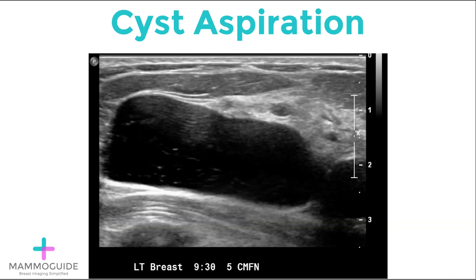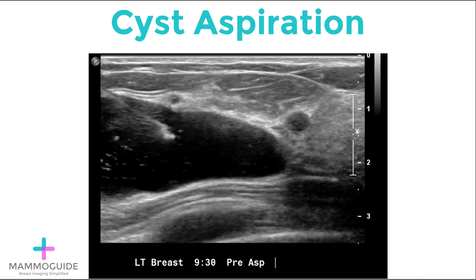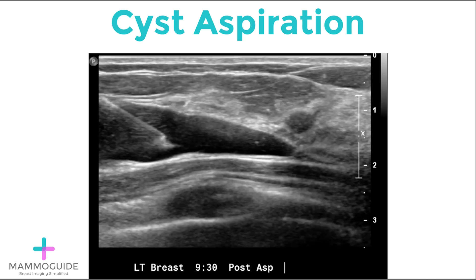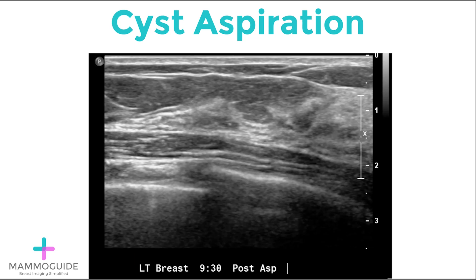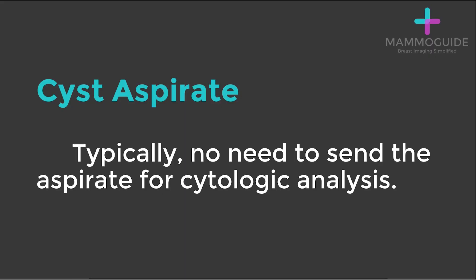First, find the cyst using the ultrasound probe. Clean the overlying skin with an alcohol swab. Next, using the needle, gain access into the cyst. Have your assistant pull back on the syringe, aspirating the fluid. Aspirate until resolution. Take a post-aspiration image to document what you've done. Usually there's no need to send the aspirate for cytologic analysis, as you are performing the aspiration simply to confirm a diagnostic suspicion or for symptomatic relief.